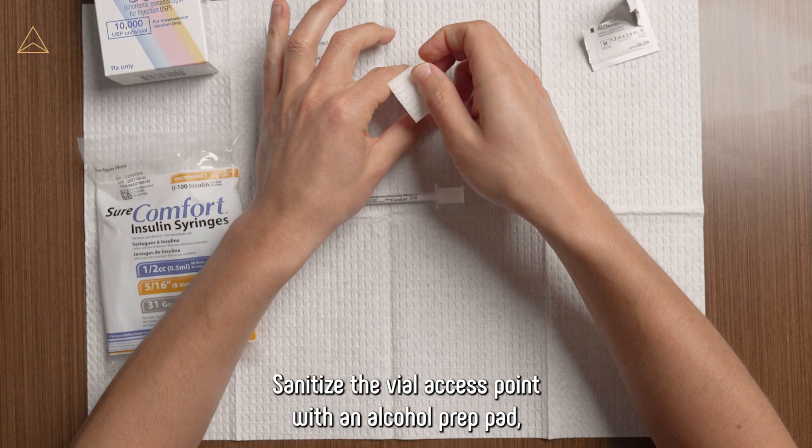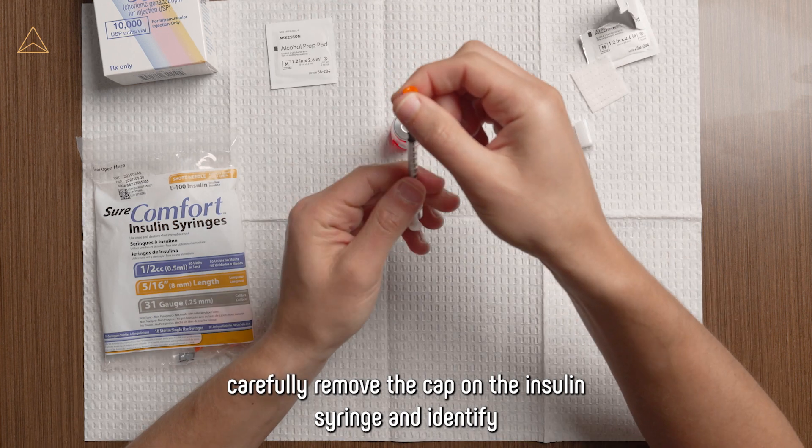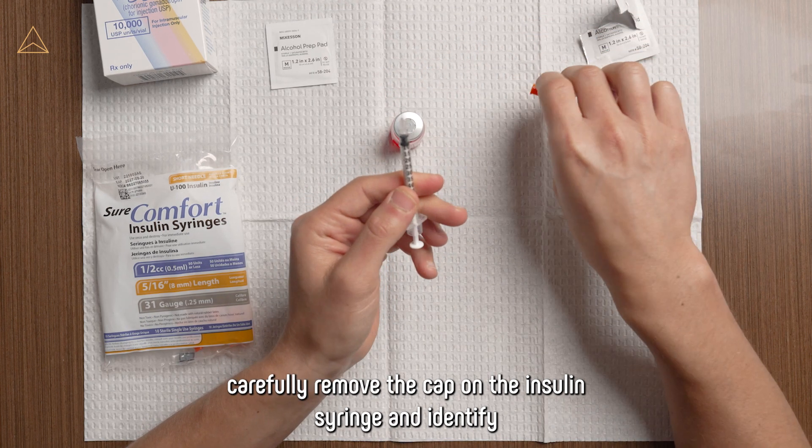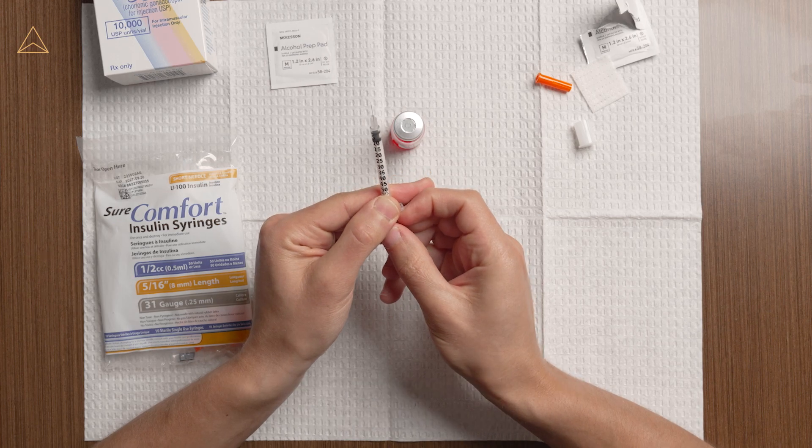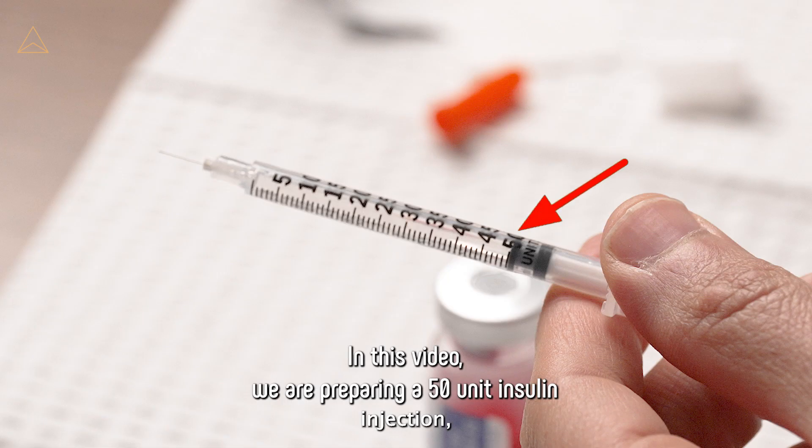Sanitize the vial access point with an alcohol prep pad. Carefully remove the cap on the insulin syringe and identify where on the syringe is the appropriate dosing of the medication. In this video, we are preparing a 50-unit insulin injection.